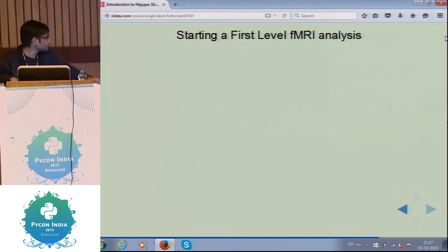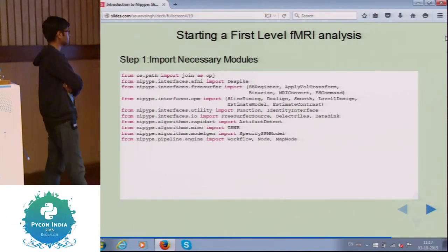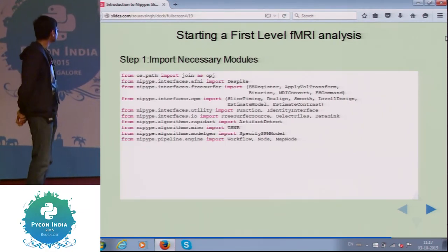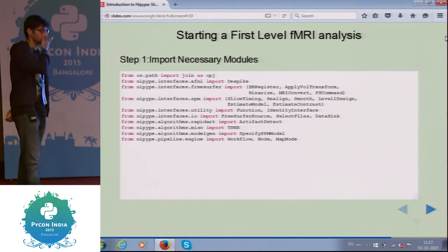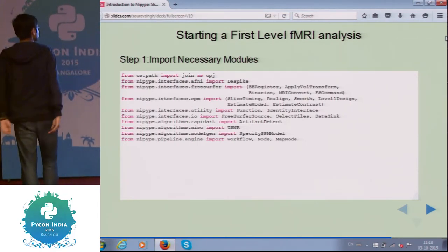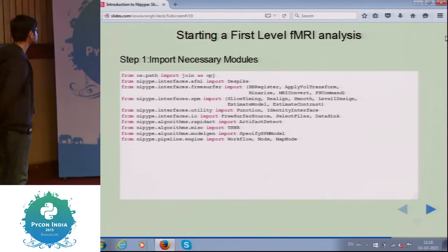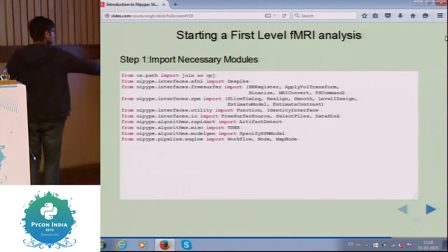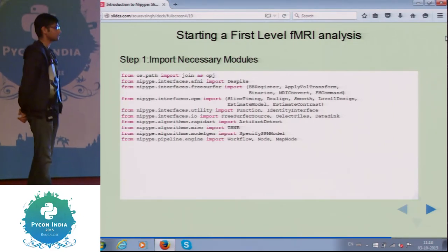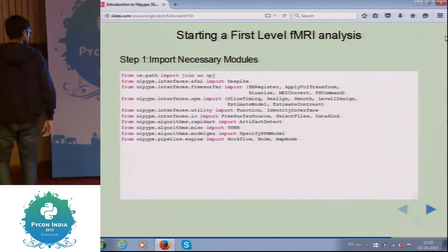This will be a first-level fMRI analysis. We first import the necessary modules required for our program — there are a lot of import statements. For example, nipype.interfaces.afni import dspike — dspike is one of the packages required to remove all spikes within your fMRI images. FreeSurfer to convert your fMRI image, make it in binary format, apply volume transformations, make a volume matrix, and so on. The final import statement is nipype.pipeline.engine import Workflow, Node, MapNode — this enables us to create our own workflow, create nodes, and link and map them together.